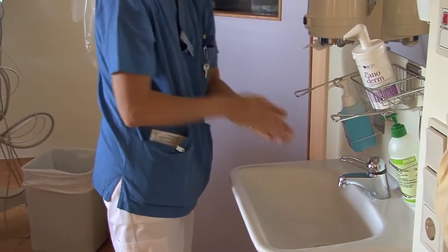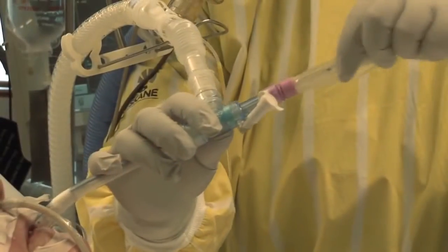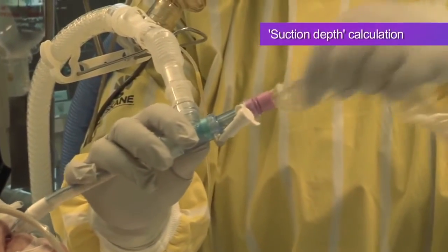Now that we've seen the stages of a typical suctioning procedure, let's look at some in more detail. First, we'll look at determining the required suctioning depth.